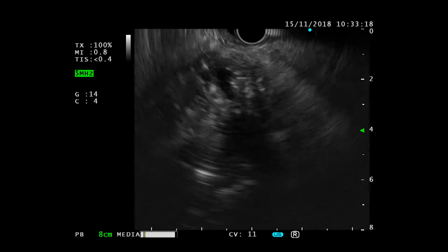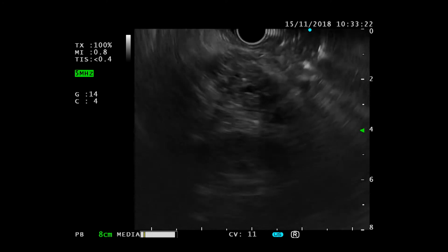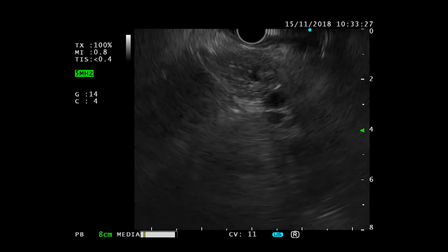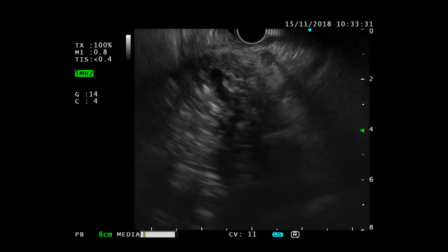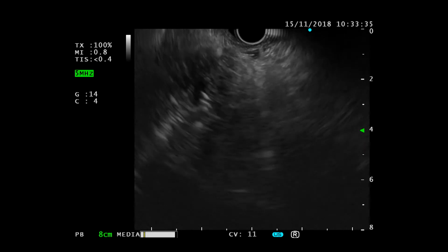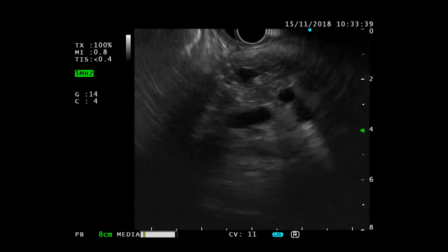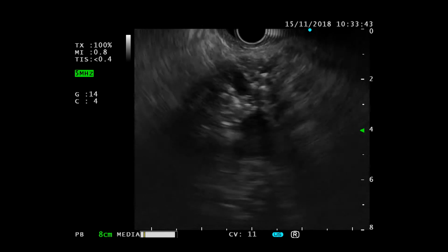structure, but nothing else. It looks like from the cross-sectional imaging, Thomas, it was more in the head or uncinate process. That's where the dilatation started, and you can see the pancreatic duct is dilated in the neck. Yeah, sure. It's slightly dilated. We can take a measure.